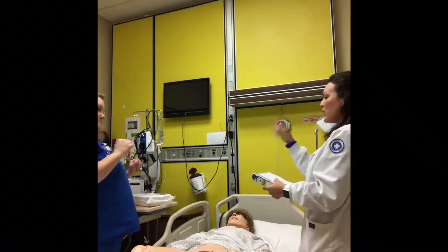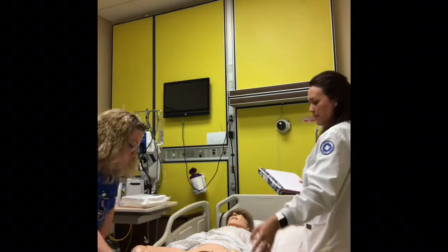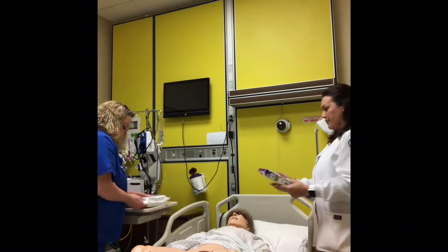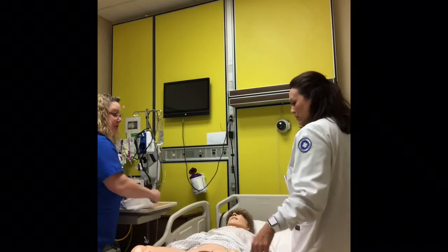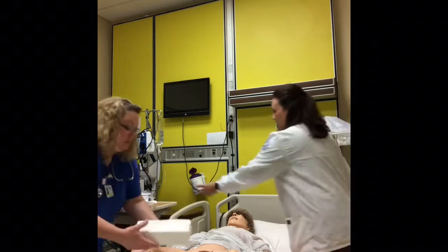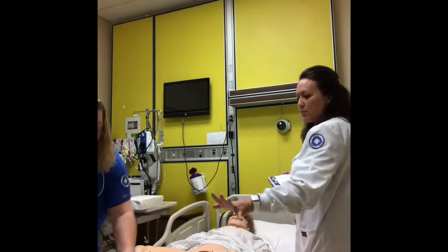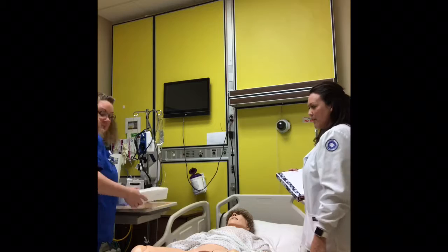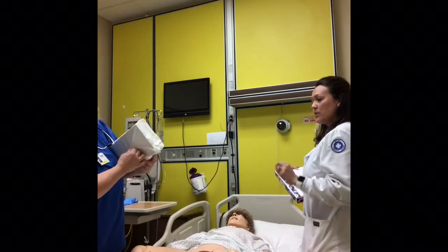Okay, what next? So now we can grab the catheter. We can open it from the outer packaging. Mrs. Jones, I'm just going to place the packaging in between your legs on the bed so it's easy to access, just for any garbage. Okay. So here we are, and there's gloves in the kit. Now try to open that kit with the sterile technique.